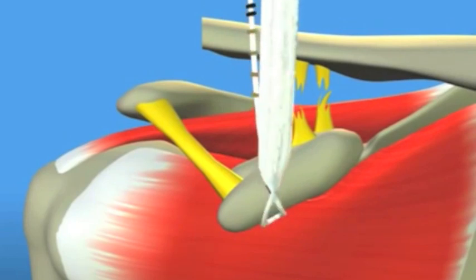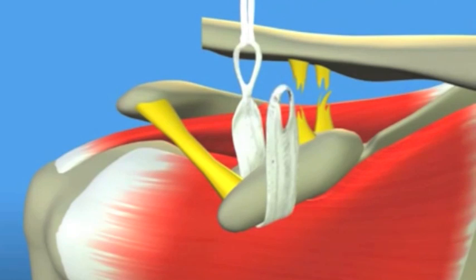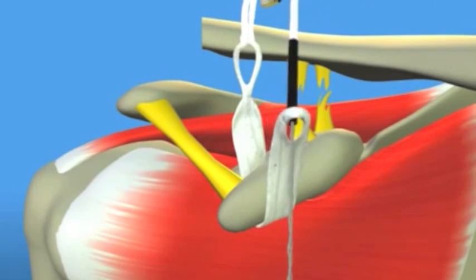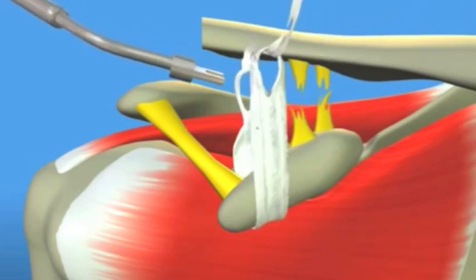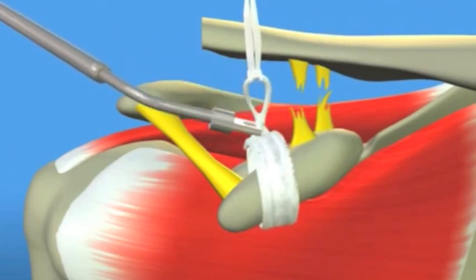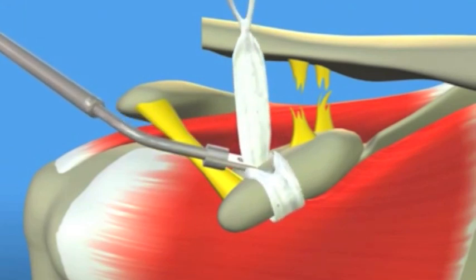Next, we pass an artificial ligament around a small bone in the shoulder known as the coracoid. You can see this being done now on the video. We then use a special instrument to make sure that it is tightly secured around the coracoid with no chance of later slippage.